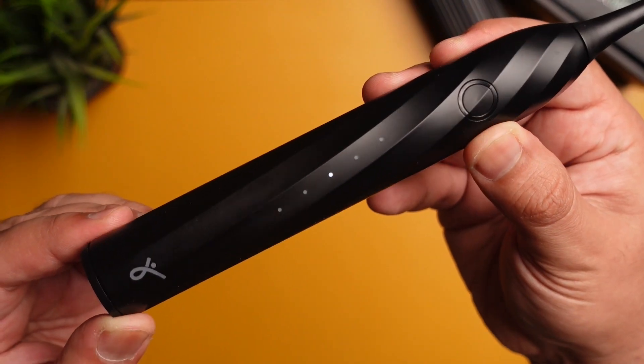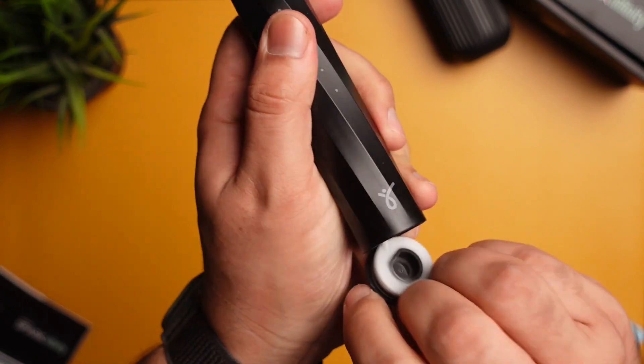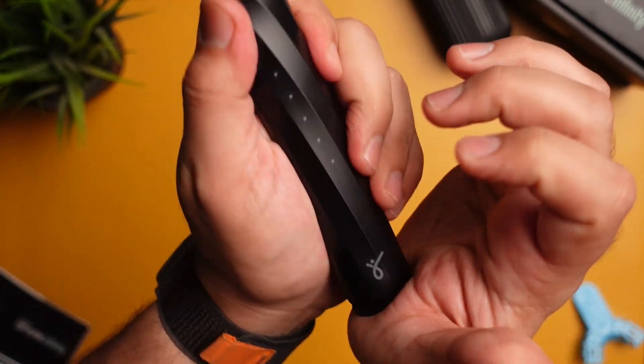There are five indicator lights for the modes. Strangely, there are no icons or names for better mode identification. At the bottom, there's a USB-C port found after opening a flap. It takes a couple of efforts to remove the flap as there's no notch to help, but it becomes easier after using it multiple times.